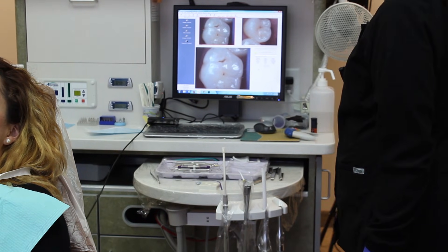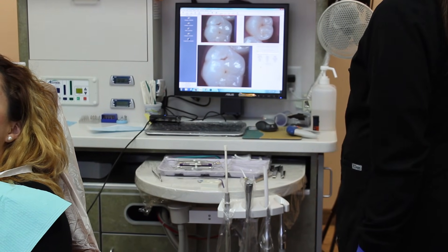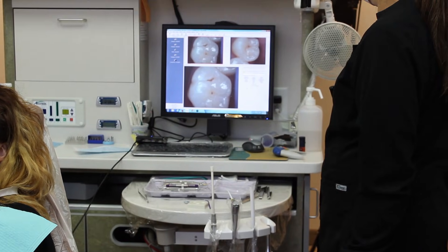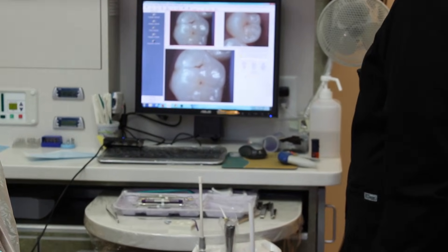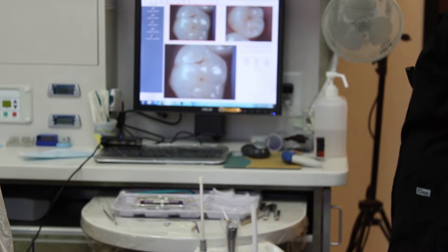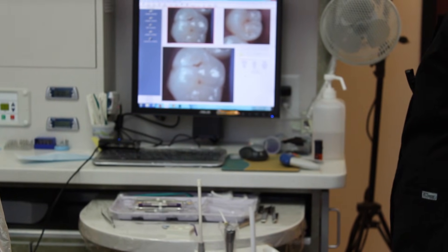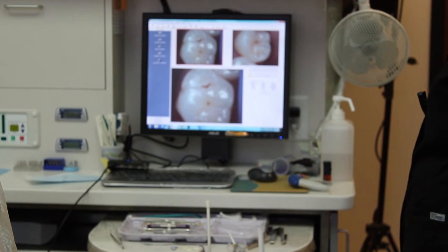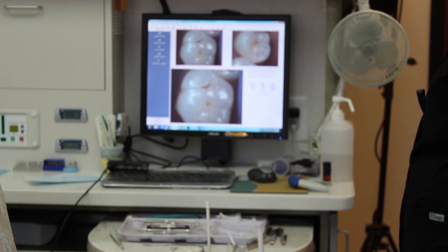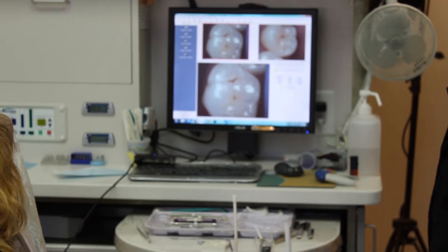With the intraoral camera I was able to take an enlarged, very clear photo of the early cavities that Julie has on the upper right. I like to diagnose cavities at the earliest stage possible because that way I can avoid having to drill away more tooth structure.